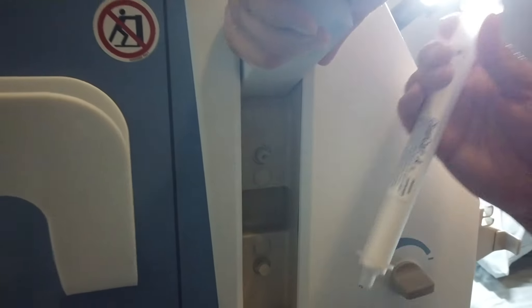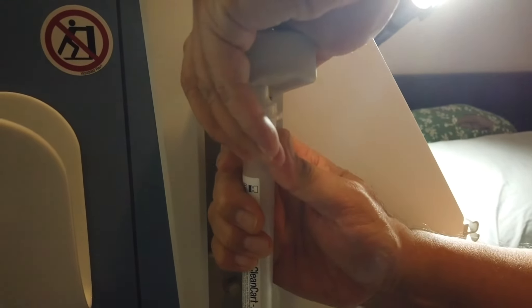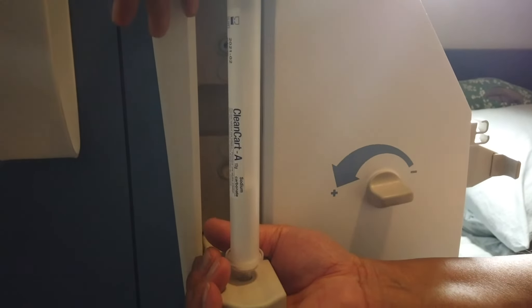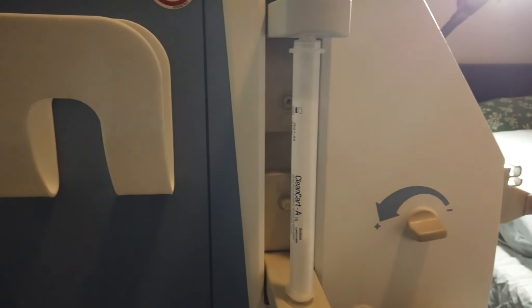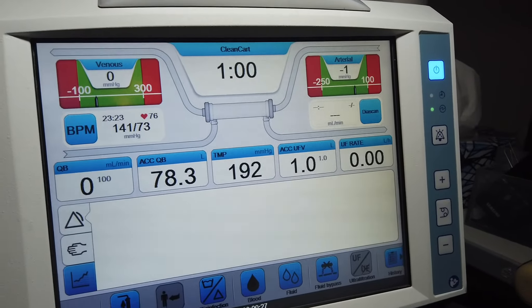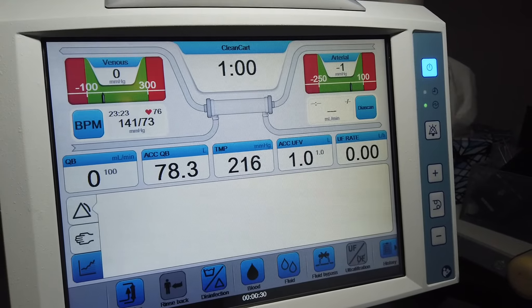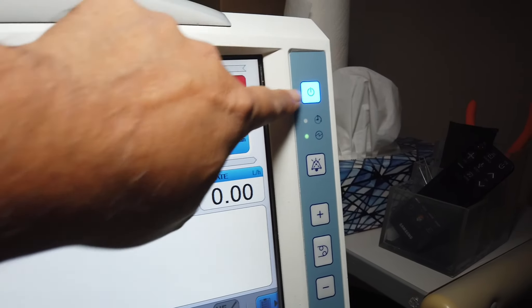We open up the two latches and take the clean cart cartridge. I normally line it up at the top first, then line up the bottom, hold the bottom, and push down until you hear the click — and that clean cart cartridge is attached. The clean cart will continue, and once we take all the information off the machine, we can go ahead and power off the machine.